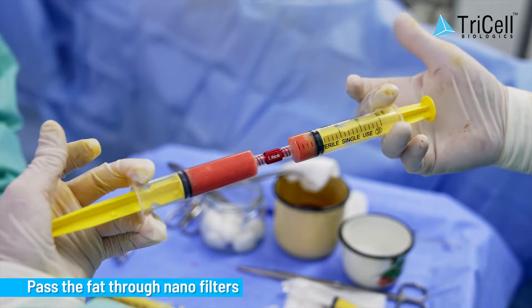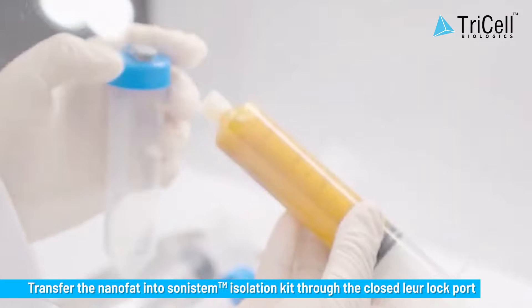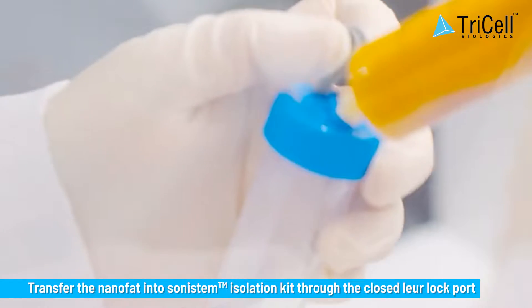Step 3: Pass the fat through nano filters. Transfer the nano fat into the Sonistem Isolation Kit through the Safe Closed Luer Lock Port.